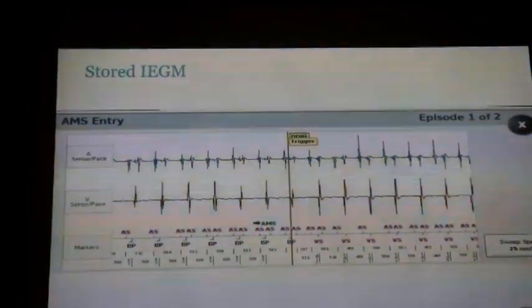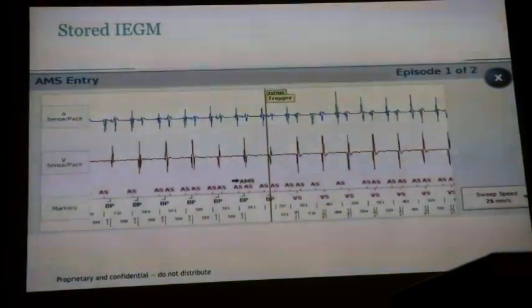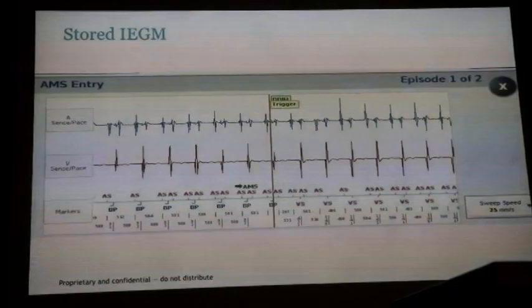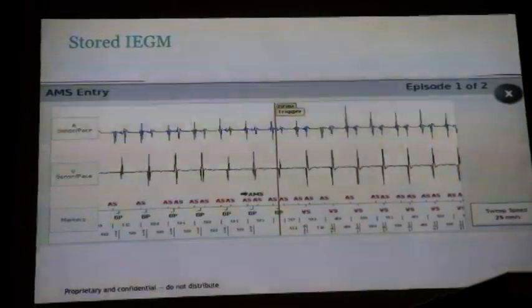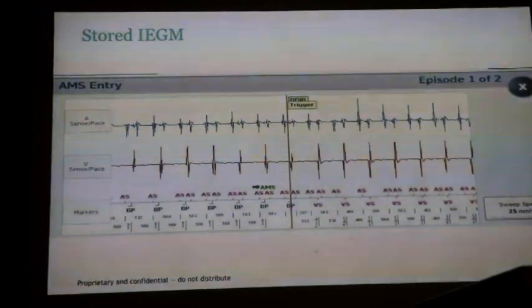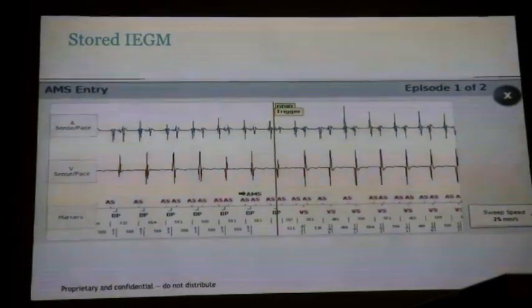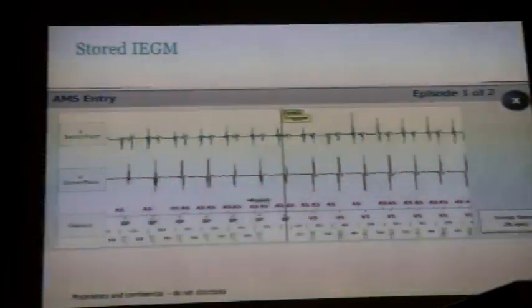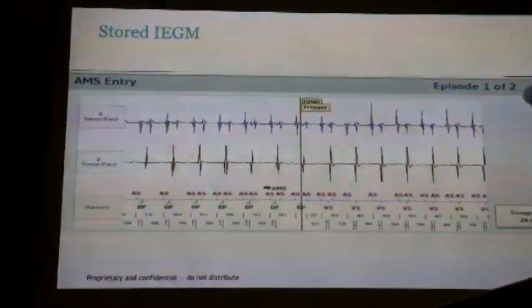And this is the problem, right? You lose BiV pacing. The device goes to a non-tracking mode, the patient's in sinus rhythm, and he conducts through his AV node. It doesn't track, so now we lose BiV pacing, and then the baroreceptors maybe detect a drop in pressure, and start to trigger the whole system off again. So this patient might have started decompensating as a result of just a far field R wave, which is insignificant, or we think it's insignificant. We don't pay enough attention to these signals, especially when you pace them.